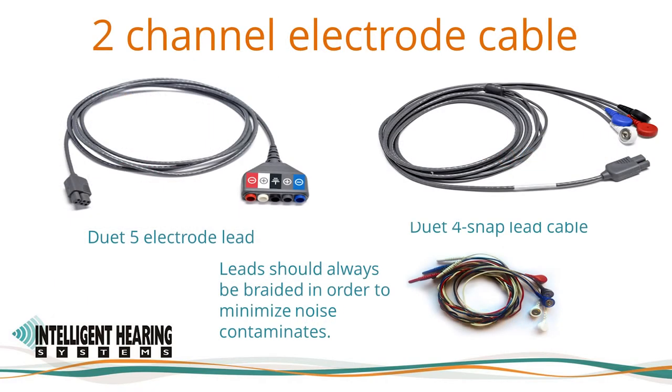On the left is a Duet five electrode lead, to which snap leads, reusable gold or silver cup electrodes, or leaded electrodes can be connected. This cable has five inputs: two negative inputs, two positive inputs, and a ground input in black. The negative or inverting input for the right channel is red, and the positive or non-inverting is white. The negative or inverting input for the left channel is blue, and its positive non-inverting input is gray. The two positive or non-inverting inputs can be joined together using a Y adapter or jumper cable.